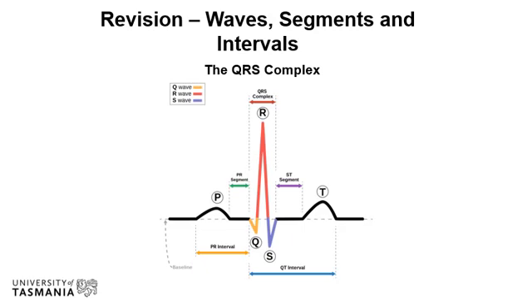The QRS complex follows the P wave and represents the rapid depolarization of the ventricles. Remember that the ECG shows only electrical activity, not the actual mechanical activity of the heart. So the QRS complex appears just before the ventricles contract. And the electrical activity doesn't always mean that there's actual mechanical activity. The contractions could be weak or even absent in cases such as PEA, or pulseless electrical activity. So it's always important to treat the patient and not just the monitor.